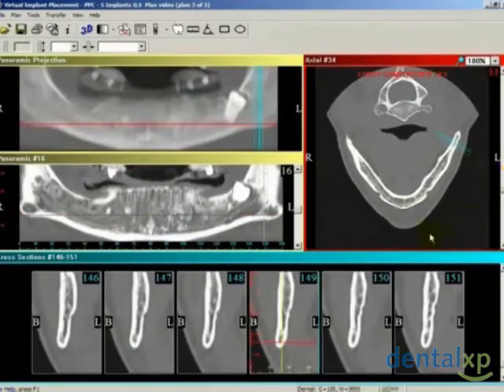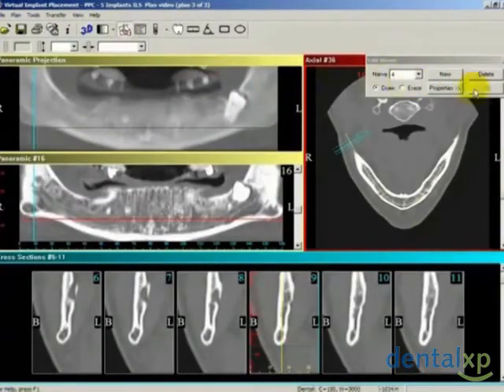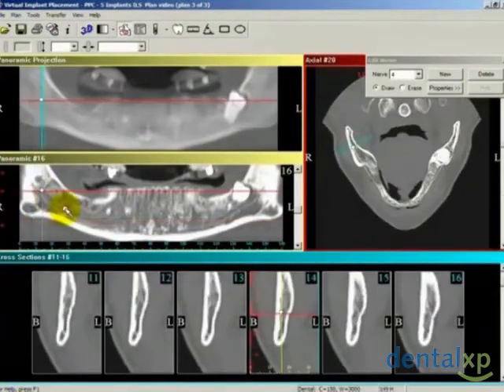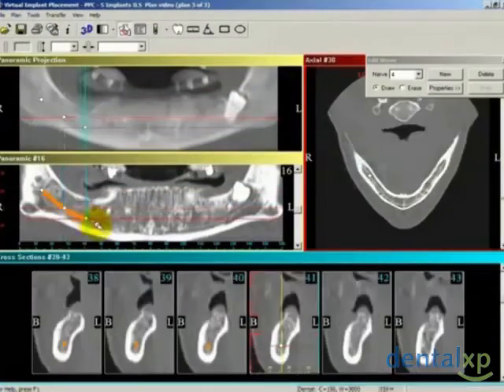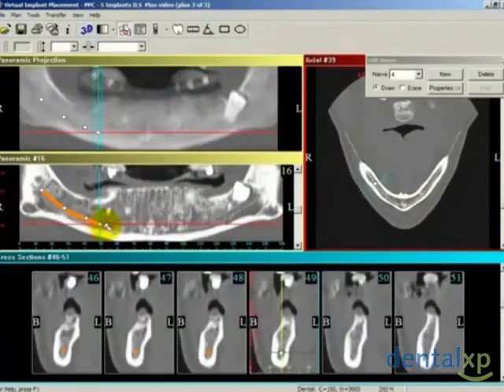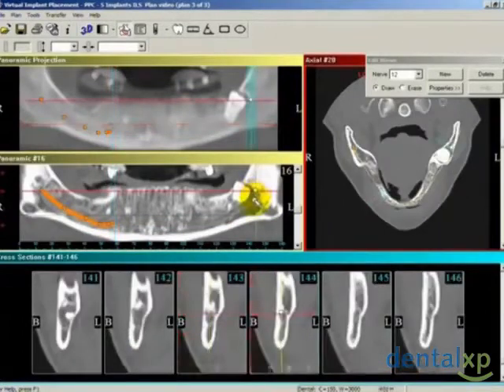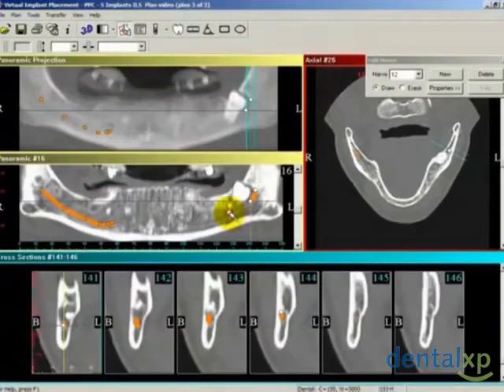VIP performs this function easily by calling on the Edit Nerve feature, and with several clicks of the mouse, the entire nerve and its extension through the mental foramen is quickly drawn. Simply pick a panoramic slice to start, anchor the first point in the posterior and proceed mesially. Within seconds, both sides can be completed.